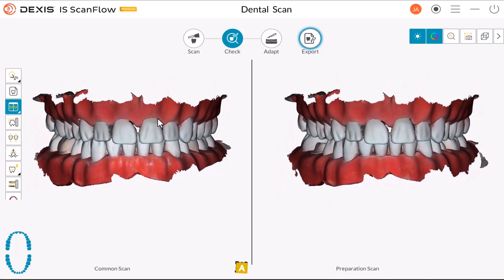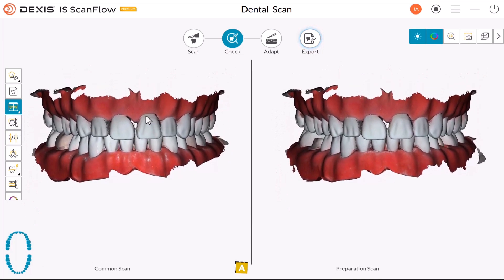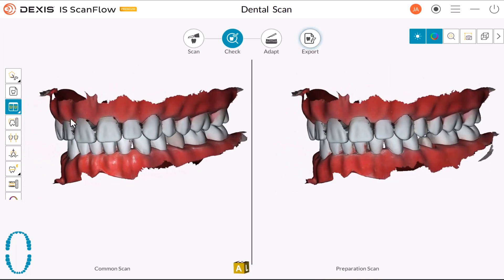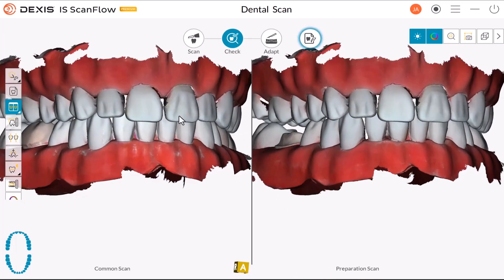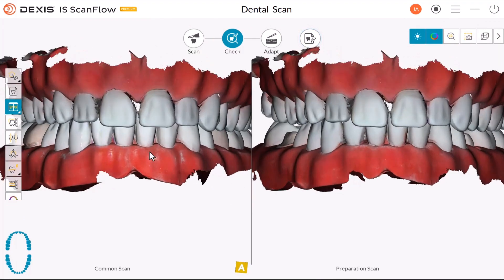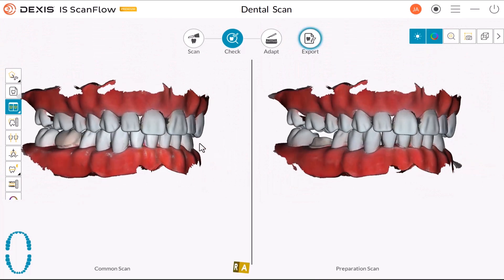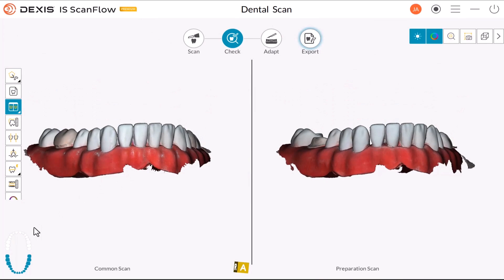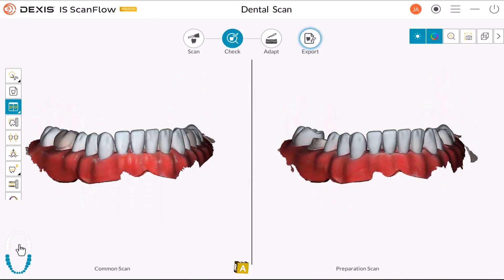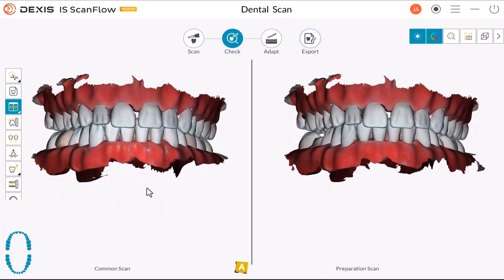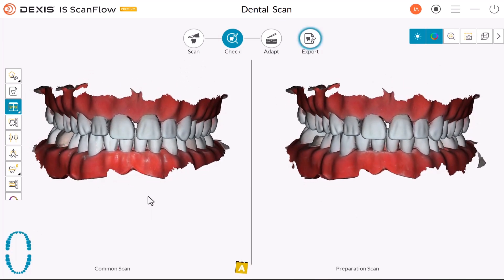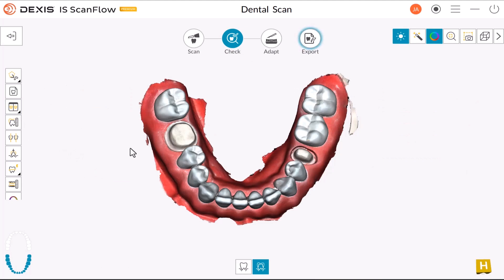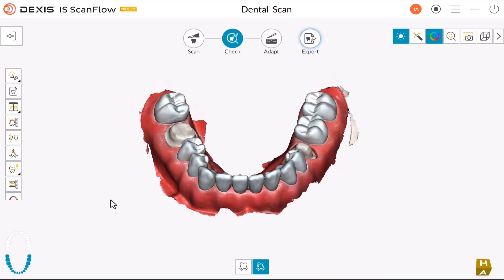Right-click and hold on the 3D model to move it in the window. Click and hold on the 3D model to rotate it. If your mouse has a scroll wheel, use the wheel to zoom in or zoom out on the 3D model. Click here to hide the upper or lower jaw. Click the button again to restore the view of the jaw. Click here to leave the split-screen view, which enables you to modify the 3D model. Images in the split-screen view cannot be modified.